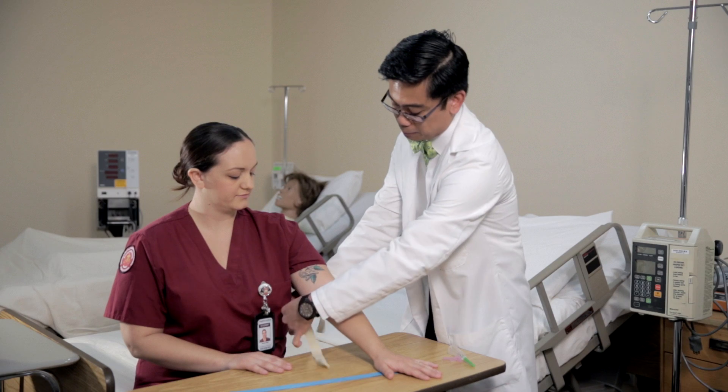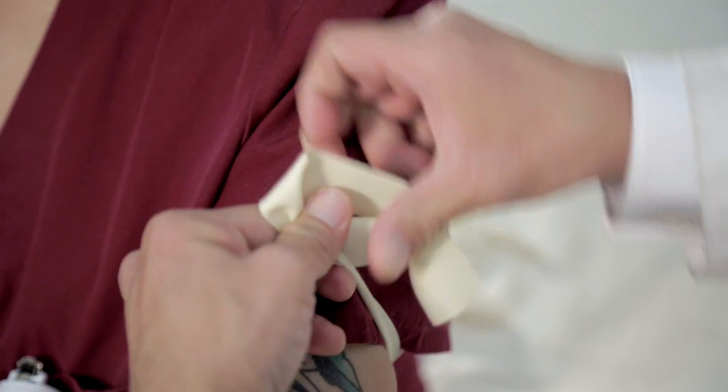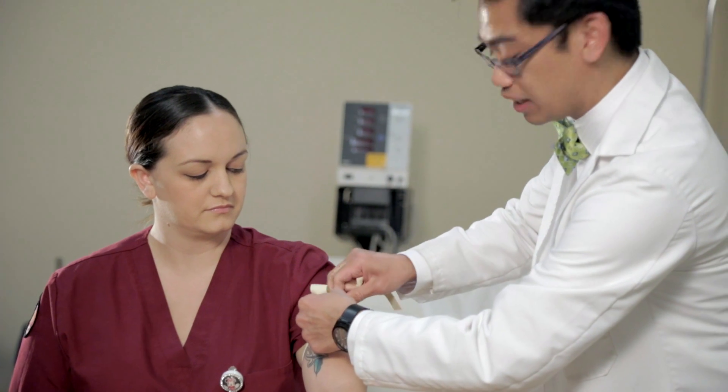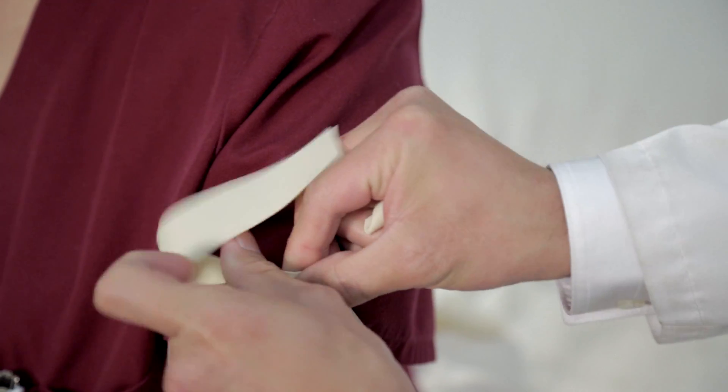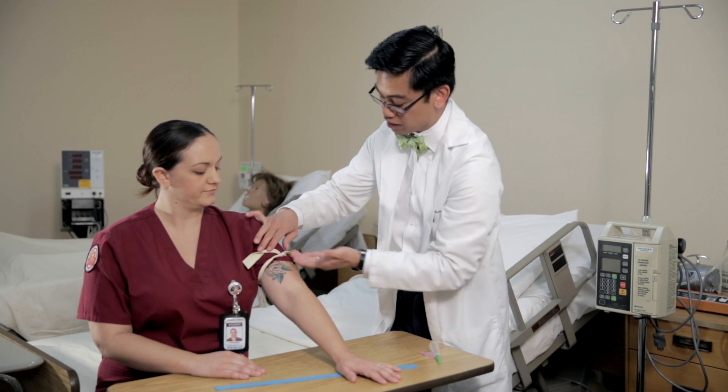Take the tourniquet, place it under the patient's arm and cross both ends with one hand. Take your other hand and pull up. By doing so, this tightens the tourniquet. Take the other hand and tuck it from above. As you can see, we made a quick release knot.